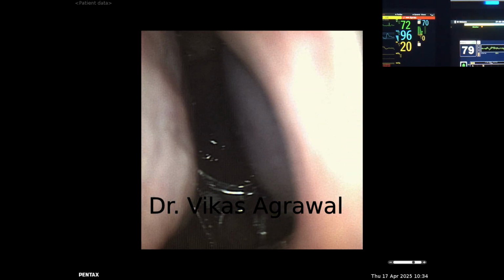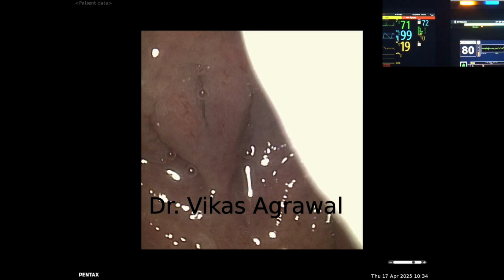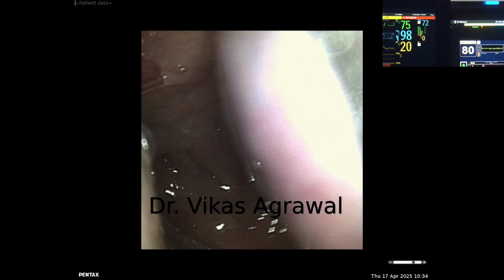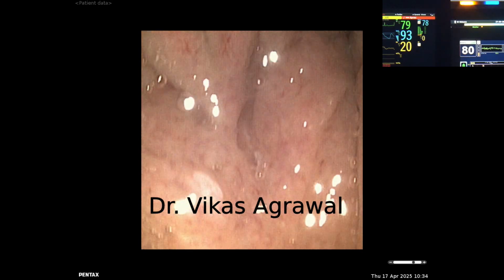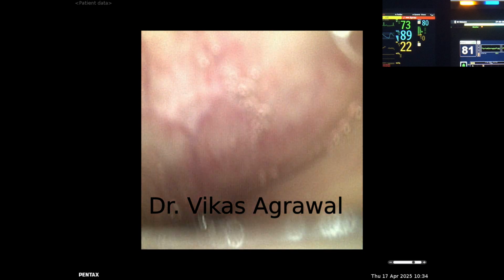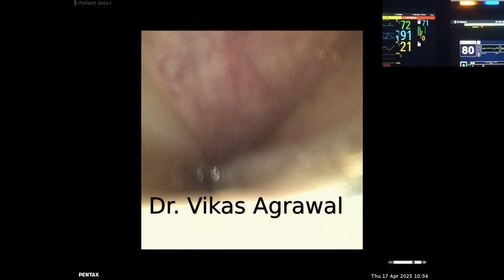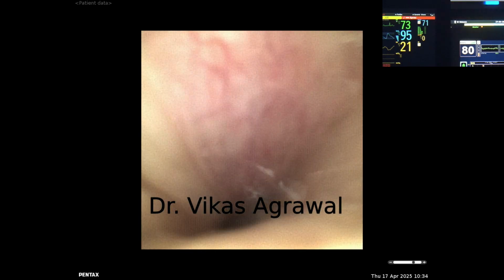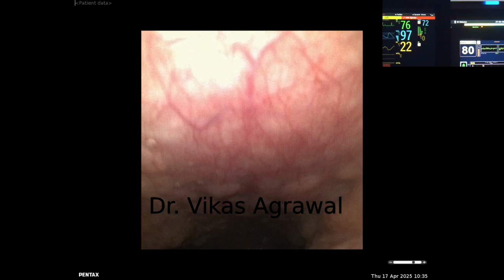As we understand, you can see his posterior part of the nasal septum is deficient, vomer is deficient. There are no adenoids. This is the inferior turbinate of the other side. Alright, so pretty large inferior turbinate. No adenoids. The salpingopharyngeal folds can say are also grade 0 or at the most grade 1.